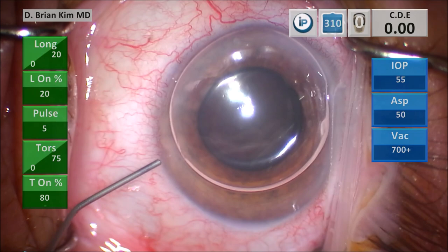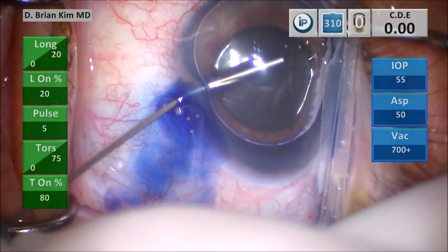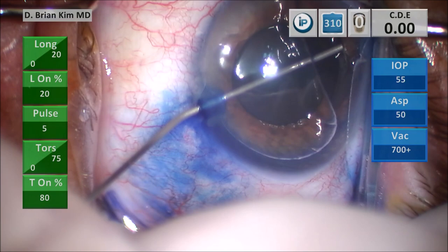I'm injecting some Trypan Blue to paint the anterior capsule surface. I don't want to be really aggressive — I just drip it and then, using the cannula almost like a paint roller, I'm just sweeping on the surface of the anterior capsule. Now I'm injecting some dispersive viscoelastic to evacuate the air as well as the Trypan Blue.